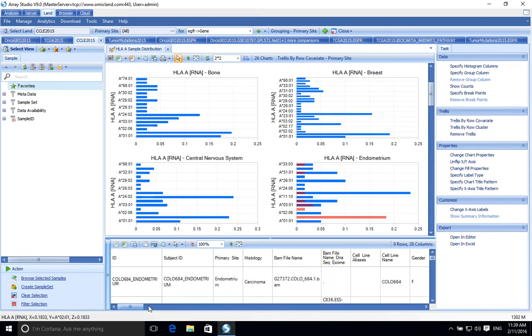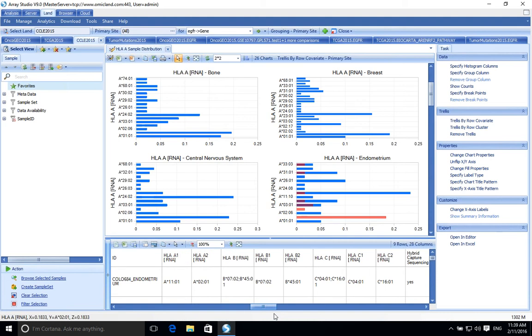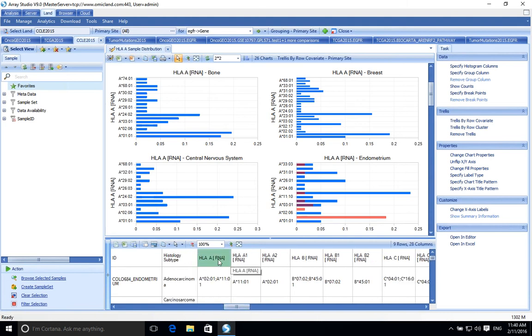okay, it's these 9 cell lines here. And then in CCLE, we've included this all in the main metadata, so you'll see the types here. The concept is you have 2 alleles, so you're going to get 2 different calls. So this one has A201 and A1101. And then what we did is we merged them together in a main column, so you could do some nicer things for filtering.